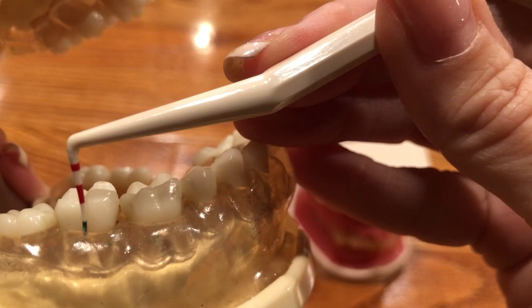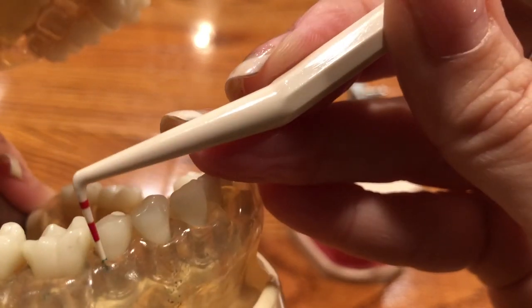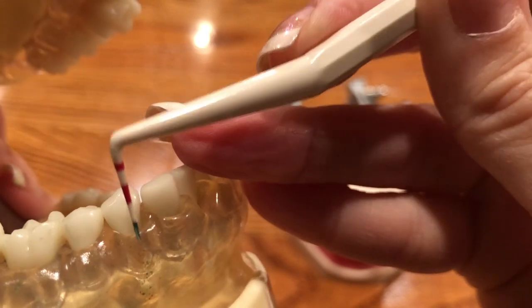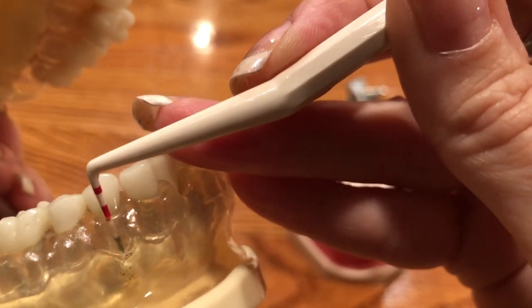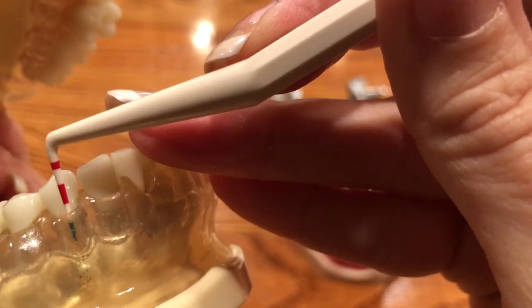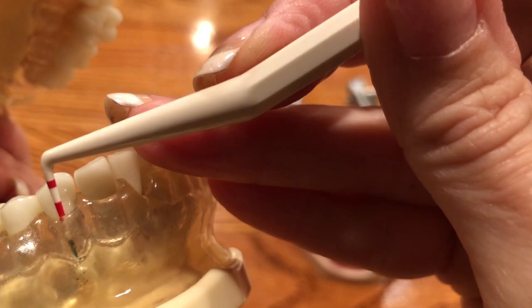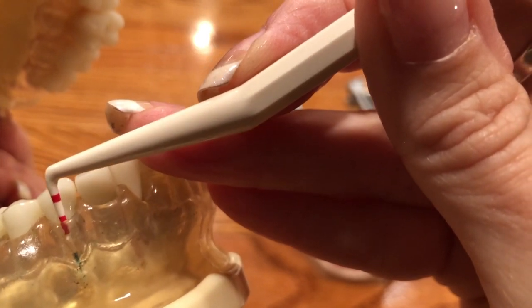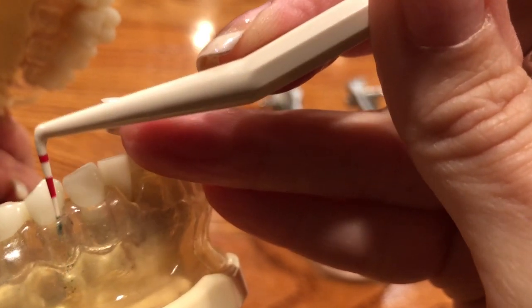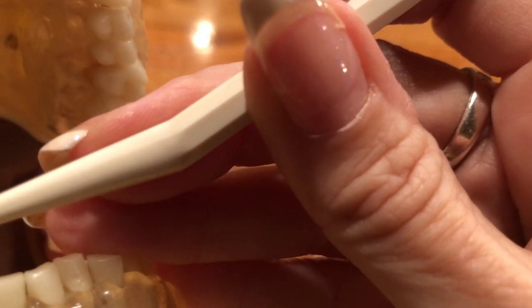And I know I'm taking a long time doing this, but I just want you to get the idea of what the dental hygienist is doing. She's walking this probe around and measuring the space between the bone and the gum here. So that's what she's doing. She's going to put this probe down, and where the bone is, that's where it's going to stop. And you have a loss of attachment here if this probe goes this far down below the gum line. So it's healthy when it only goes to the green here.